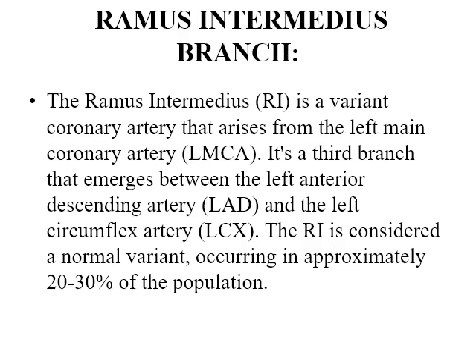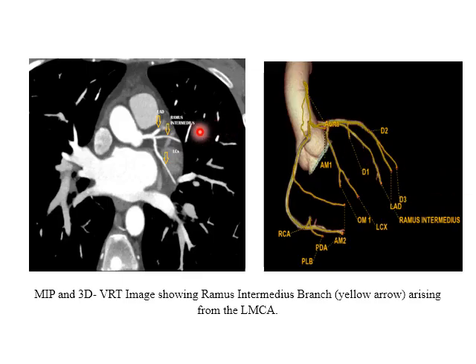The ramus intermedius is a variant coronary artery that arises from the left main coronary artery. It is the third branch that emerges between the left anterior descending artery and the left circumflex artery, and it is considered a normal variant occurring in 20 to 30% of the population. On imaging, we can see the LAD, the left circumflex artery, and the ramus intermedius running between them.